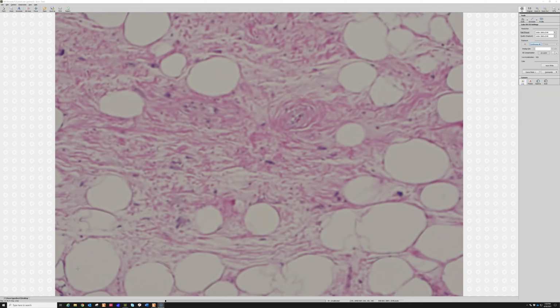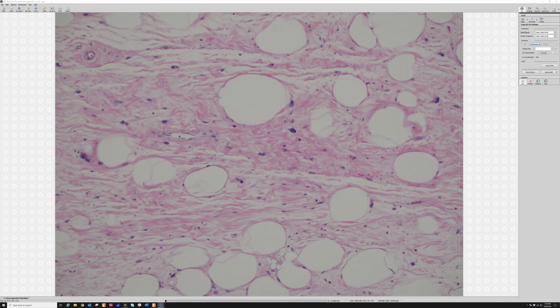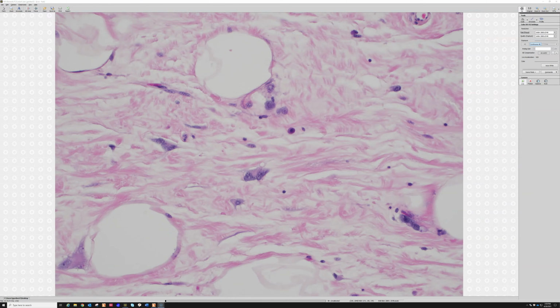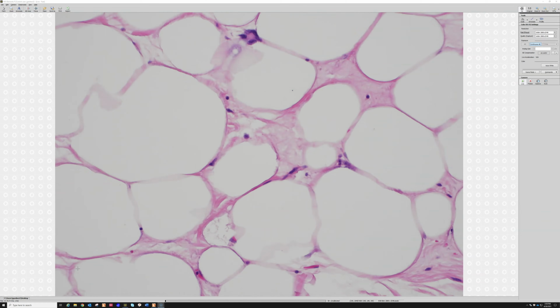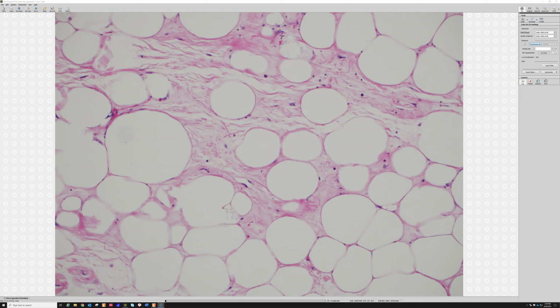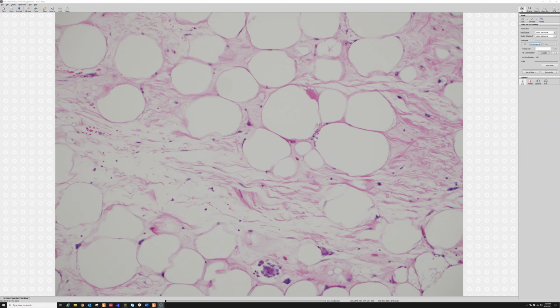Sometimes it's kind of strands like this. Other times it can be really homogeneous and very sclerotic and packed together. And then you're already probably noticing, what are these guys? Big, hyperchromatic, atypical pleomorphic cells scattered around in the midst of this. And so what I've just described for you is the characteristic triad that you want to see in well-differentiated liposarcoma, also known as atypical lipomatous tumor, depending on where it occurs. In this case, we have a retroperitoneal mass. We call it well-diff liposarcoma.